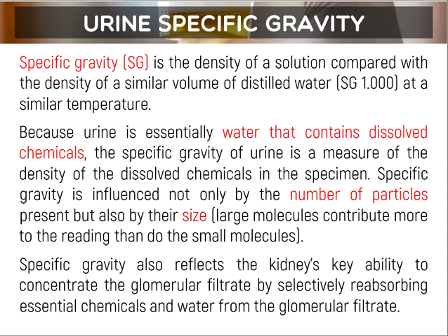So urine color is directly proportional to Sg or concentration.